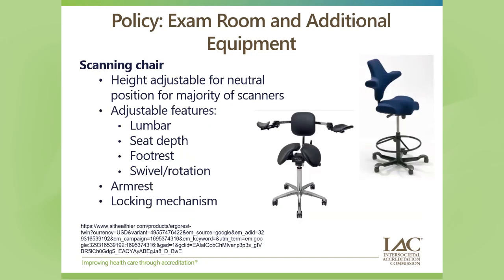And then scan chairs are very helpful. There's a lot of different ones out on the market, and we want to ensure that the height is adjustable for neutral position for the majority of scanners. So again, thinking about it like we did with our ultrasound system and our workforce that we have, is it going to go up high enough or down low enough for the different scanners and the different heights that we have, and the modalities that you're working with if you're a multimodality facility.